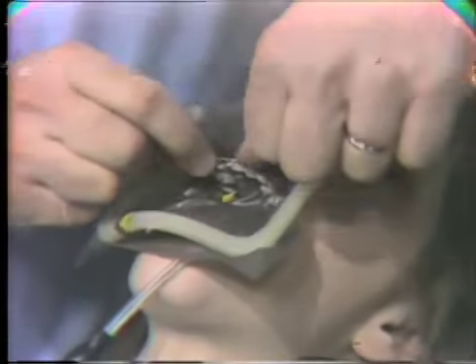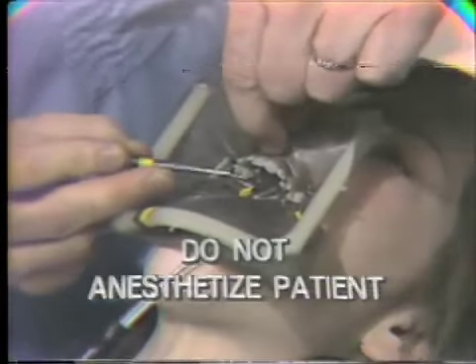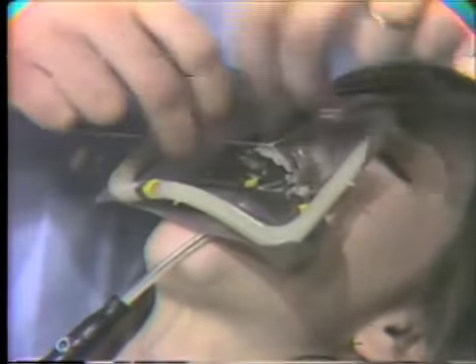Now if you notice, Carolyn is a little bit uncomfortable when we do this. The gingiva, of course, is quite tender. But again, I remind you, do not anesthetize this patient. A little bit of discomfort here is well tolerated because it's better again than producing permanent damage to the tooth with heat treating on an anesthetized patient.